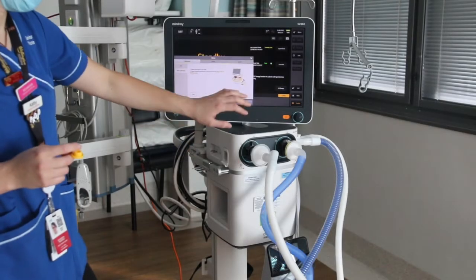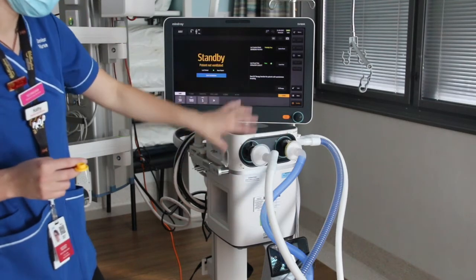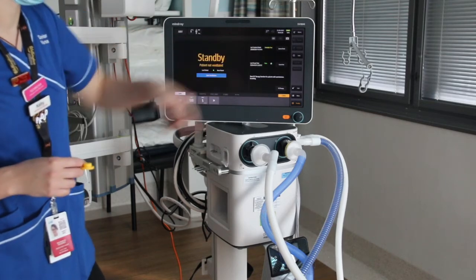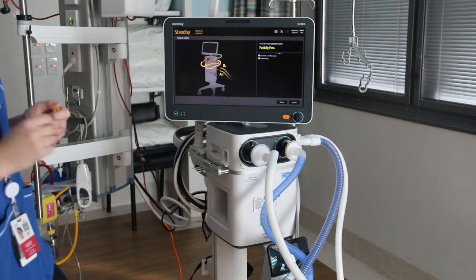Once you've done that and your flow sensor is happy, the next step is your tightness and your general system check. That option comes up here on the main screen — system check. This test only takes about two minutes and is checking the tightness.